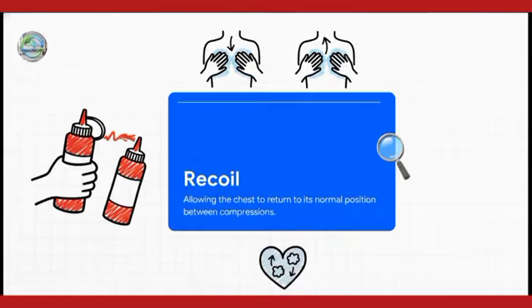blood. Okay, so equally important to the push is the release, which is known as recoil. You must allow the chest to completely return to its normal position between compressions. Think of it exactly like a ketchup bottle. When you squeeze the bottle, ketchup comes out, right? But to get more ketchup into the nozzle for the next squeeze, you have to let the bottle completely expand. If you don't let the chest fully expand, the heart has absolutely no time to refill with blood, which means you're doing a ton of exhausting work with zero actual benefit to the patient.